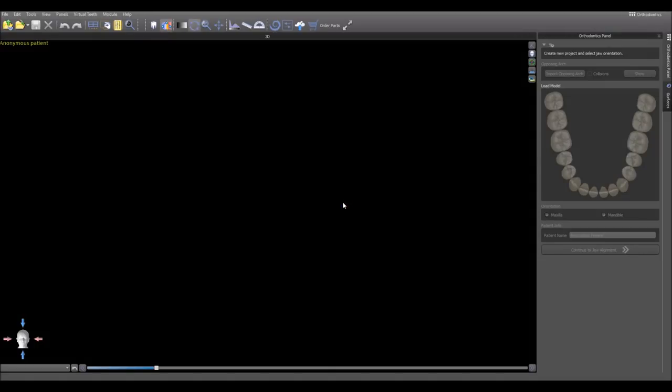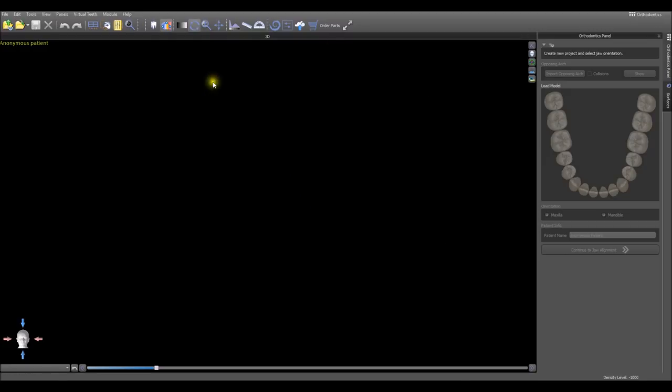We're going to be demonstrating and presenting the new Ortho module in the Blue Sky Plan software. You should see a screen similar to the one you see in the video now. If you don't, click on Module and switch to Orthodontics.